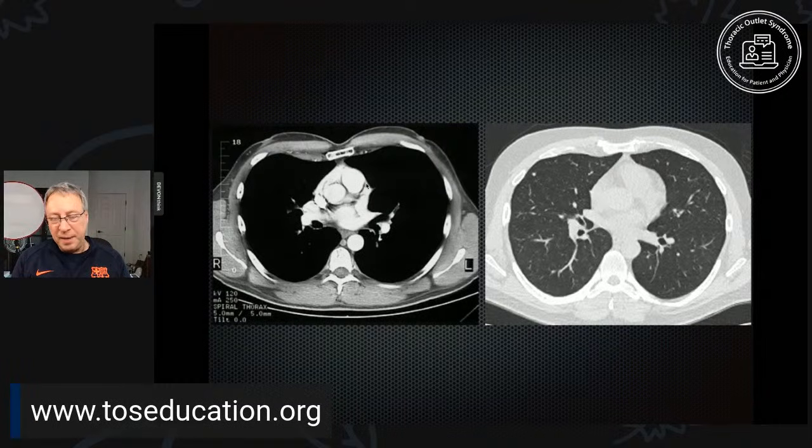Now, the image on the right: if you manipulate the image on the left, you can make the lungs show up, and you can see the structures within the lungs. Now, you see that the bones and the muscles and the fat are all kind of a light gray, and they're harder to distinguish from one another.